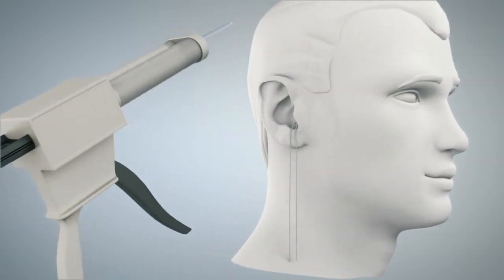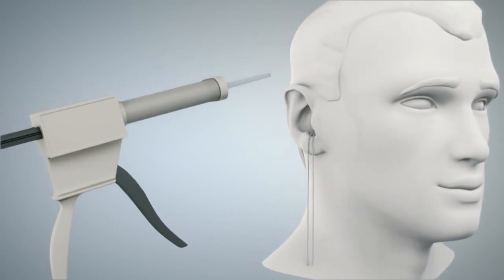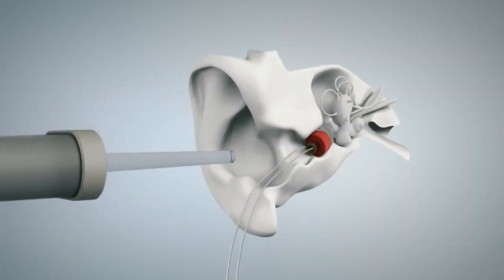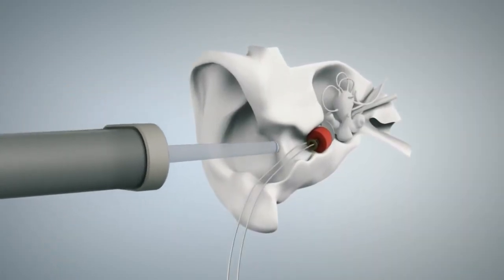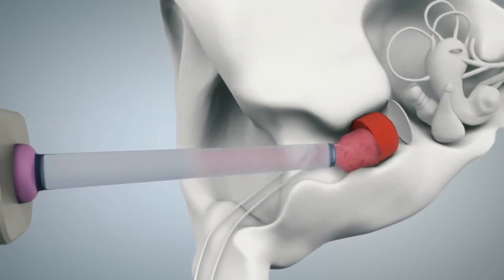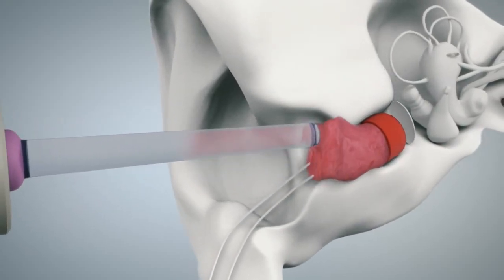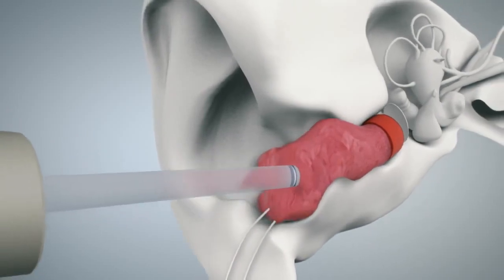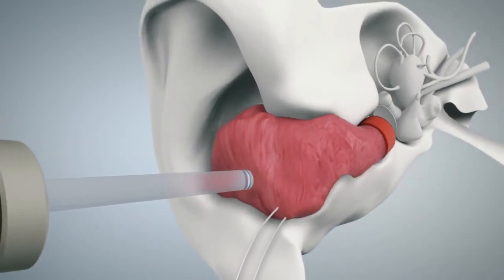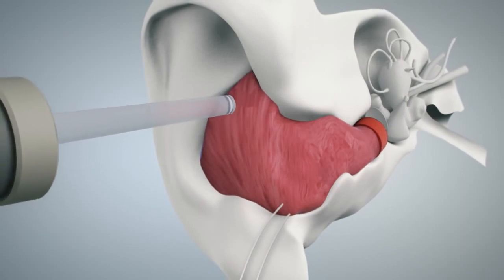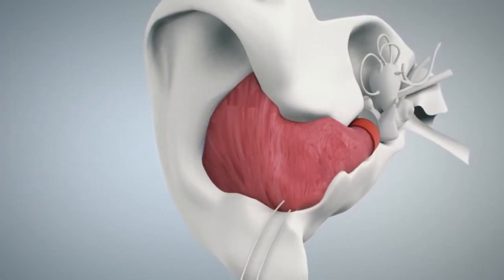Now to make the impression, all you need is standard silicone in a standard syringe. Just as you would with any ear impression, push the silicone into the ear canal. It will envelop the bullet of the impression dome, which now works like a barbed hook in the material. This ensures that all of the material can be removed safely and comfortably.